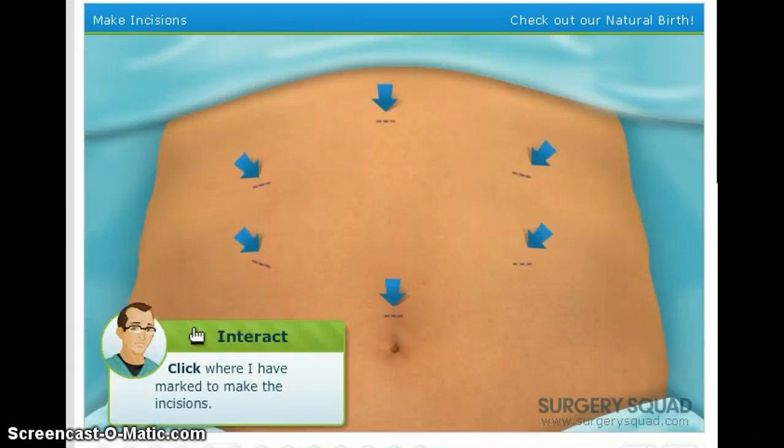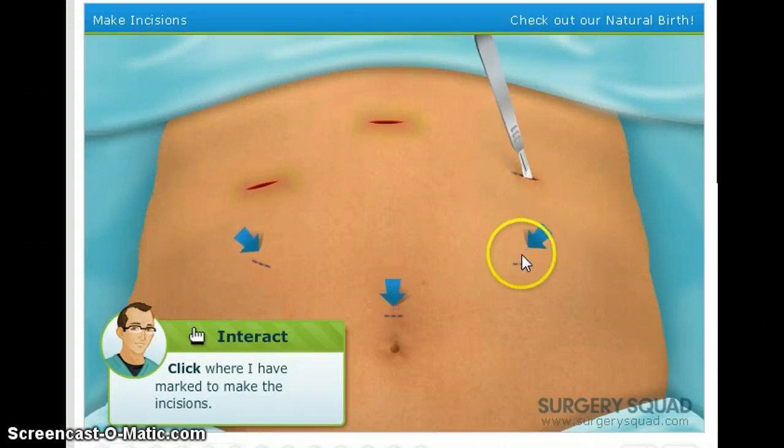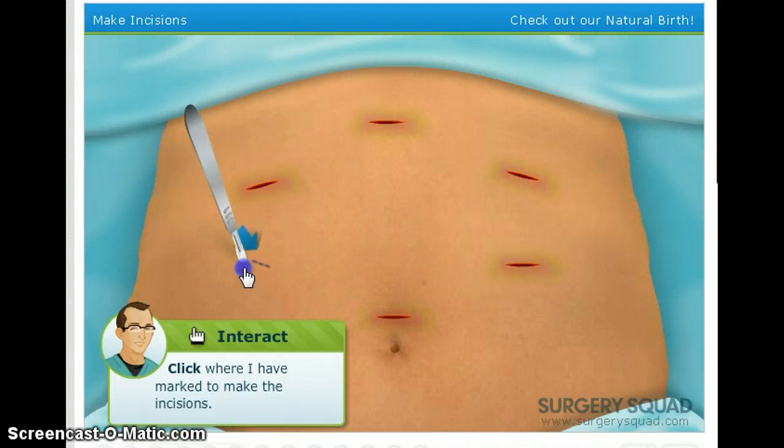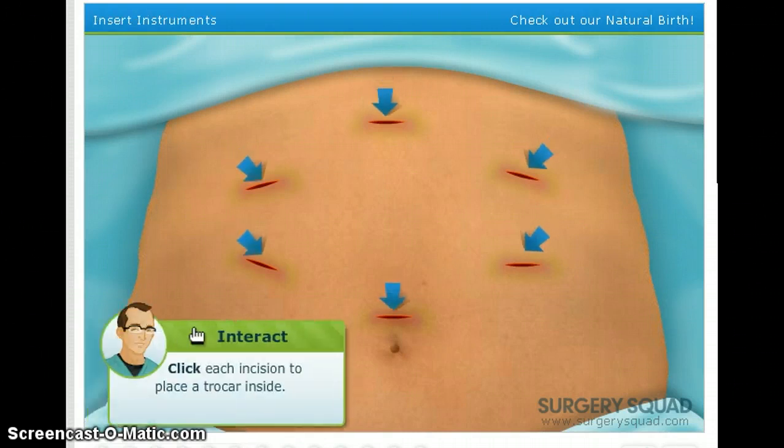The first thing we'll do is make 6 half-inch incisions in the abdomen. Slide the scalpel in where I have marked to make the incisions. Be careful. These are small incisions. Don't get carried away. Slice. There are bruises. Nice technique. You must have an excellent teacher. Oh, wait, that's me. Next, we'll place a device called a trocar into each incision.